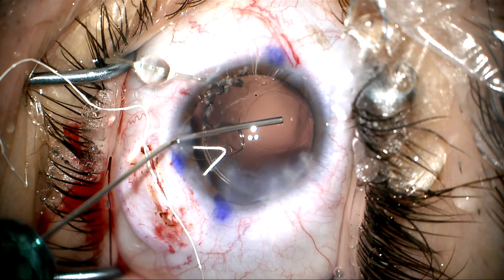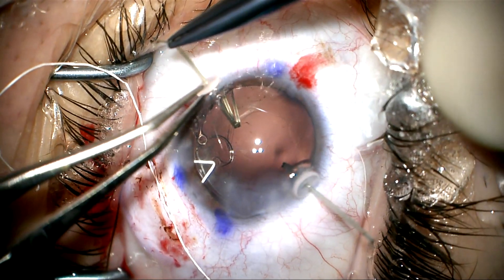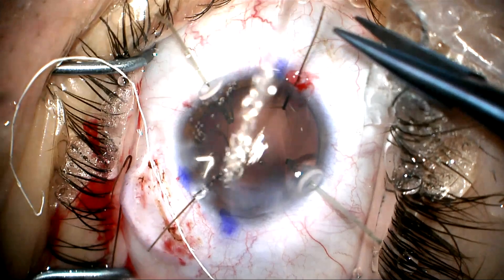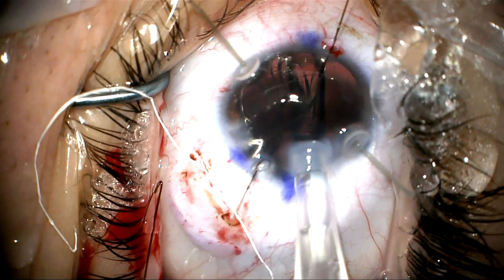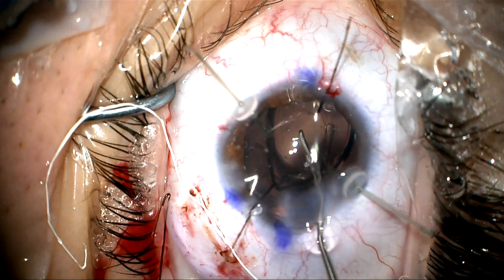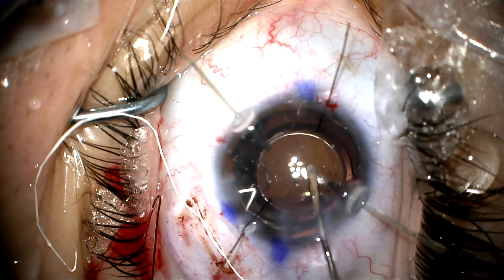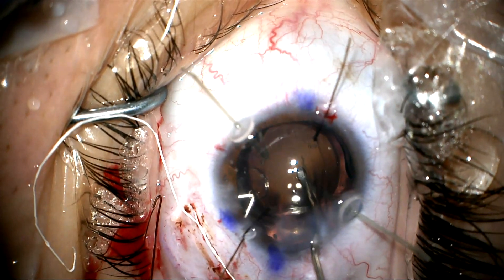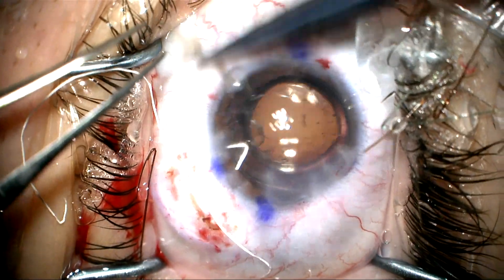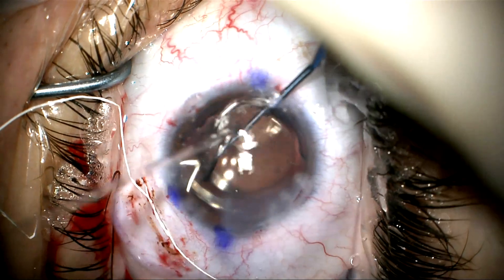Now we're going to inflate the capsular bag with cohesive viscoelastic to expand the anterior capsule and stabilize it so we can inject our lens into the bag. We're injecting our single-piece extended depth of focus toric lens. We're going to rotate that to the correct axis of 70 degrees, which we marked at the beginning of the case — you can see the little red mark, and that's where we're going to line this up. Now we'll remove the iris and capsule retractors and sweep the anterior capsule for lens epithelial cells, which will help avoid capsule contraction down the road.